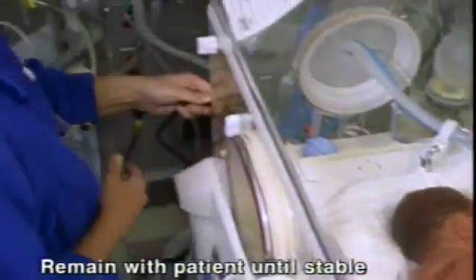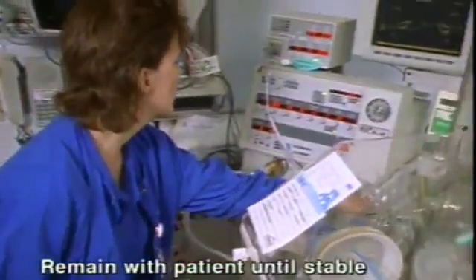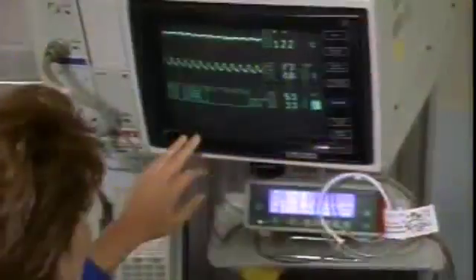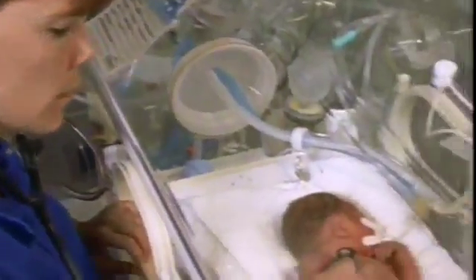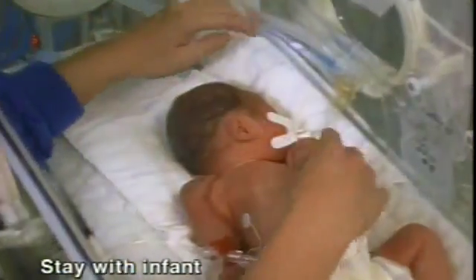After dosing, remain with the patient until stable. Change ventilator settings as compliance improves, or if you detect acute deterioration. Regardless of the strategy used, certain observation and monitoring procedures should be followed. Anticipate marked improvements in oxygenation and lung compliance within minutes of giving Surfactant. Stay with infants after dosing.